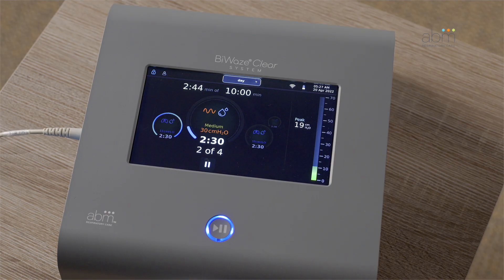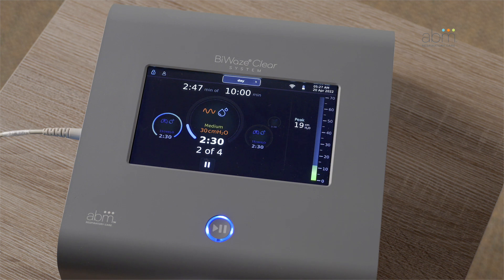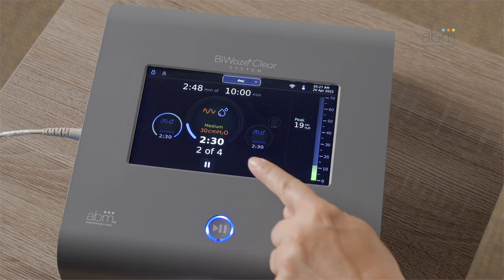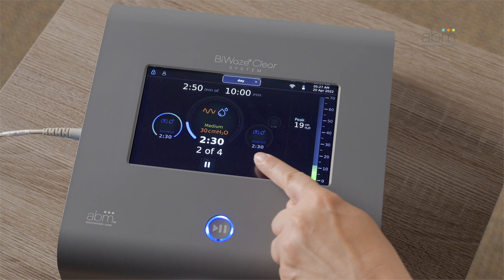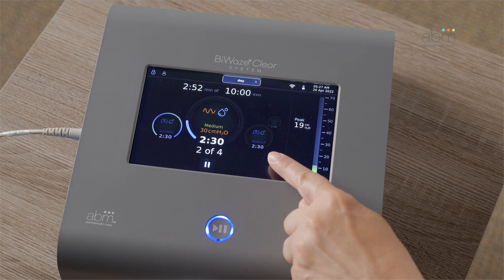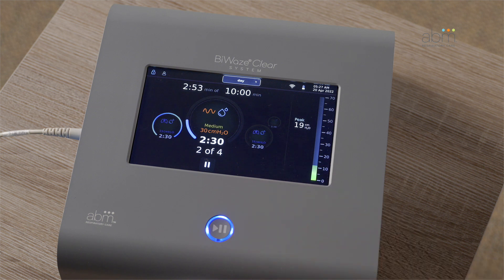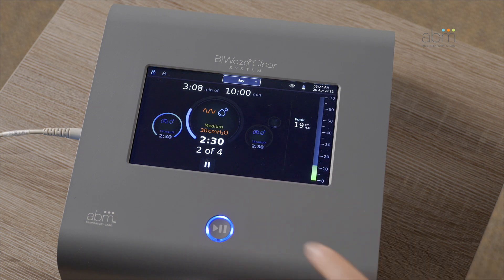In Auto Mode, the device will go through the entire programmed therapy and will display the current phase being delivered and the upcoming phase. The therapy time on the top will allow you to track how much time you have left.